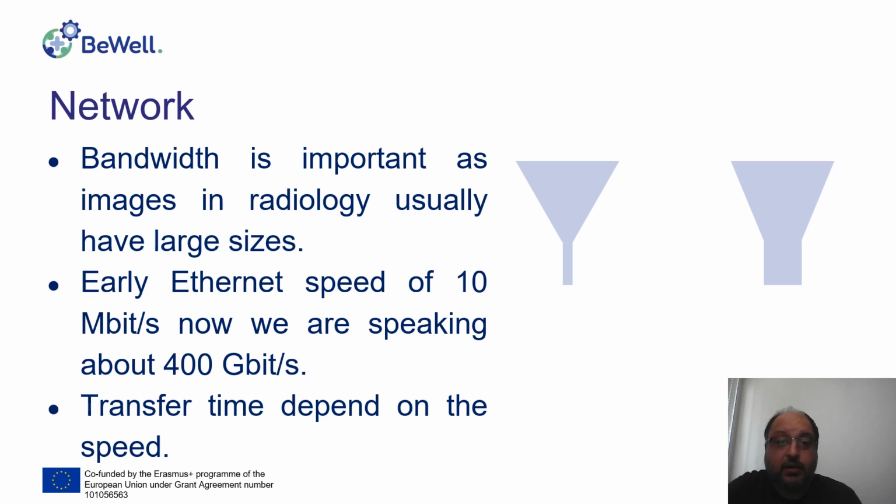So once again, the picture archiving and communication system is software plus some other systems, but most of the hardware is not usually considered as part of the picture archiving and communication system. So when you purchase the PACS, do not expect to have the modalities and the network included in it, and sometimes you may have to purchase the servers additionally.